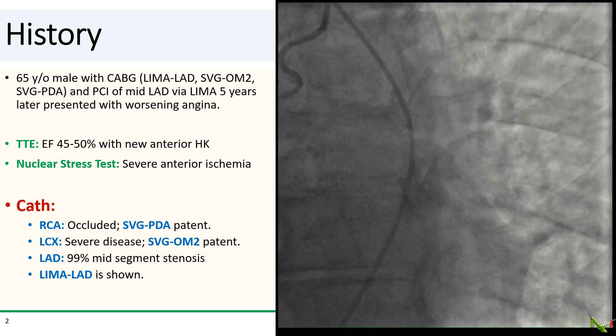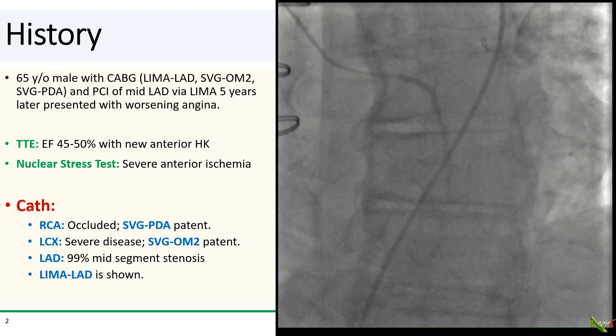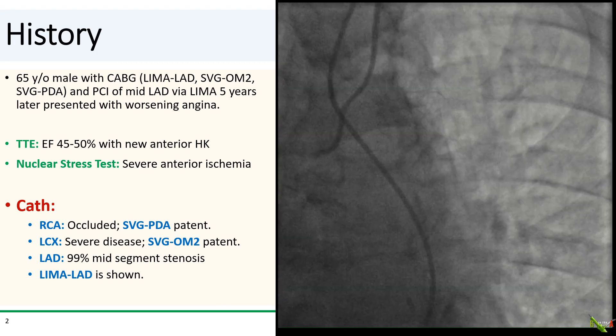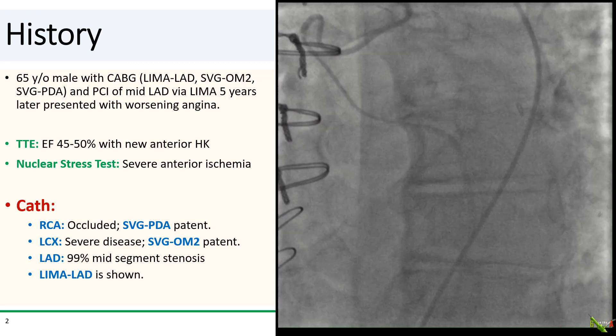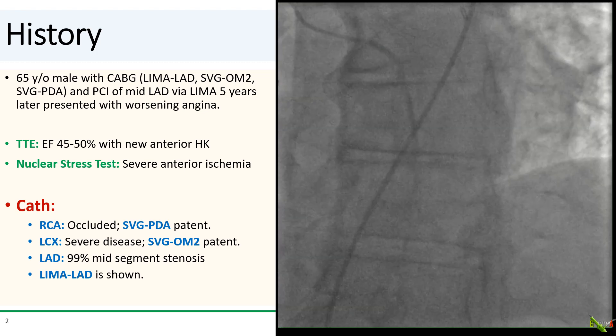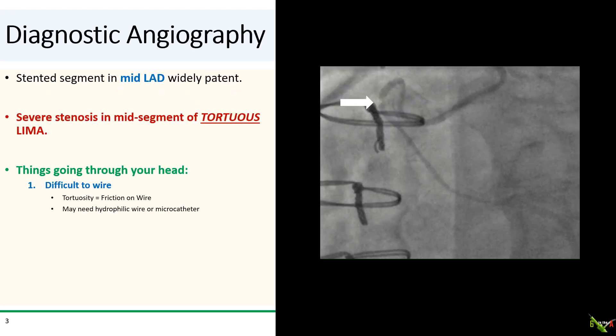On cath, the native coronary arteries were all either occluded or had severe disease. Fortunately, both vein grafts were patent and the LIMA to the LAD is shown. The stented segment in the mid-LAD was widely patent. We see a focal severe stenosis in the mid-segment of the LIMA. This is probably the culprit for his angina, anterior ischemia, and anterior hypokinesis.